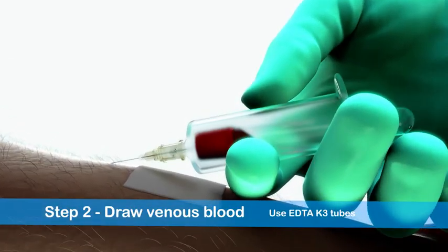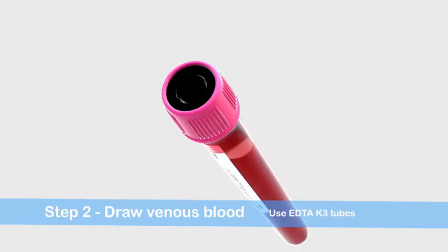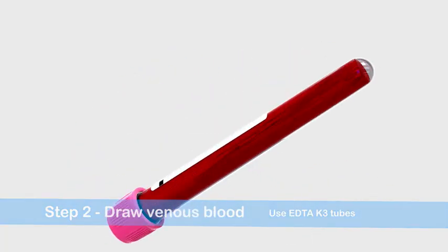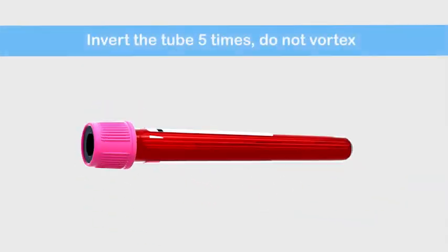For the second technique, collect venous blood in a collection tube and immediately mix it by inverting the tube five times.